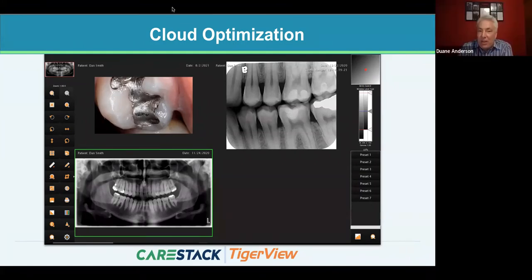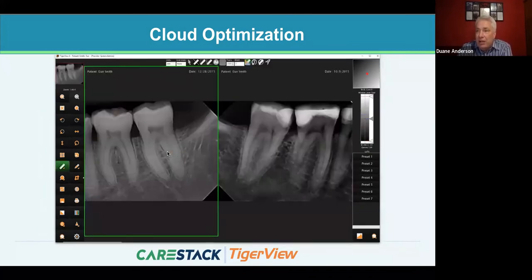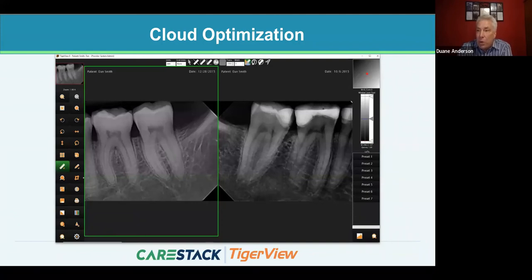TigerView's open architecture allows you to acquire images from multiple sources and view images captured with three different devices on one screen. You can toggle between a full screen and a layout view. For comparisons, you can view two periapicals or two bite wings side by side — for example, one taken today and one from six months ago — making it easy to see the progression of what's happening with a patient's tooth.